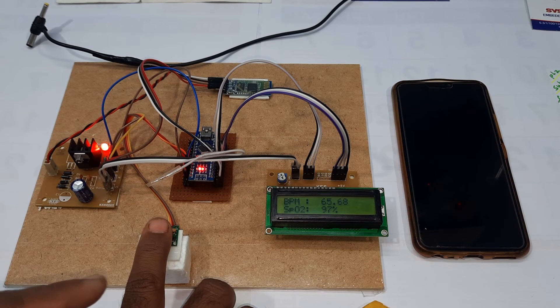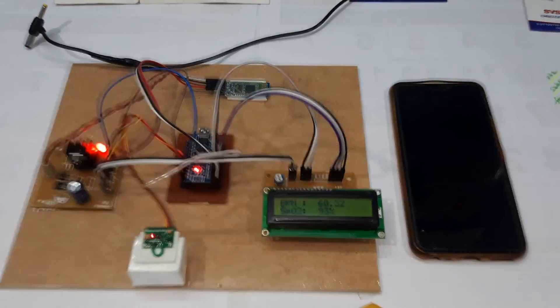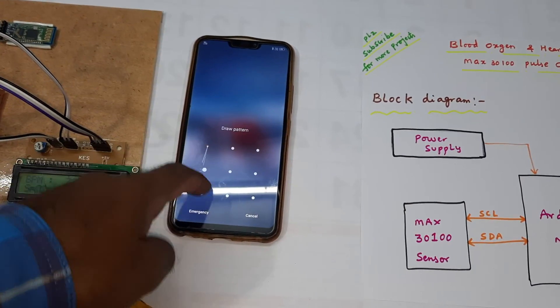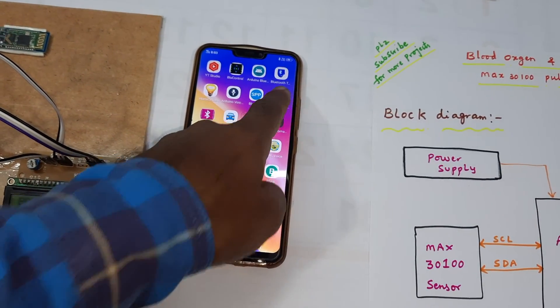If you connect your finger properly, the values should come accurate. This is our block diagram. We are using the HC-05 Bluetooth app available from the Google Play Store.